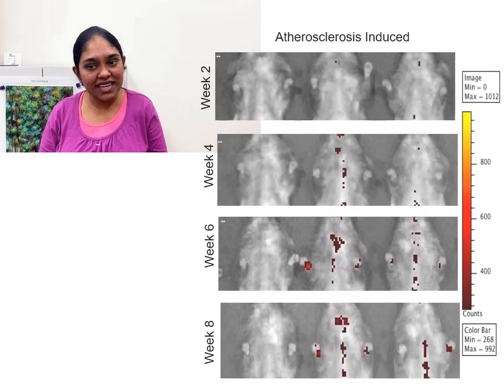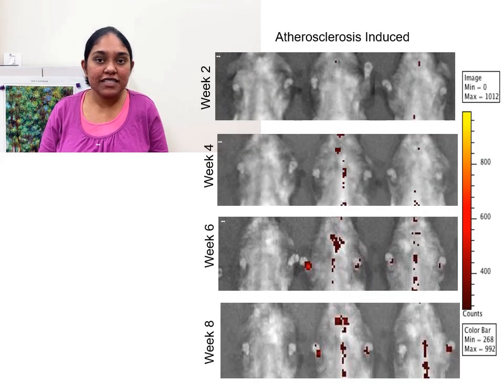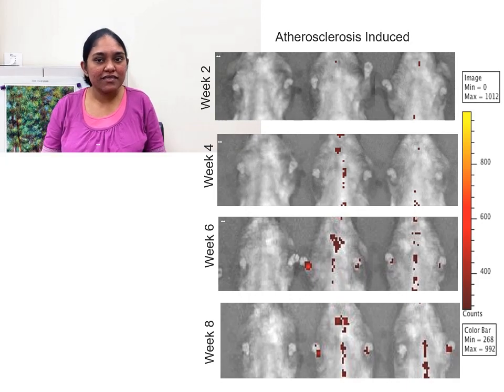Our imaging system has the advantage of imaging the atherosclerosis development in the same mice as time course data and could image 5 mice at the same time effectively. We are using our imaging system to screen potential treatments for atherosclerosis and also working on development of new in vivo imaging systems for other diseases.